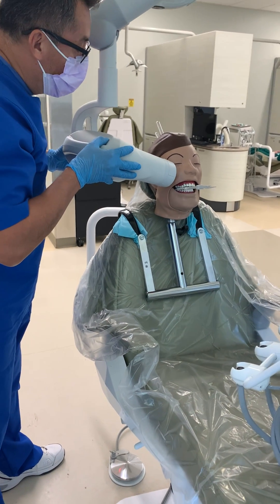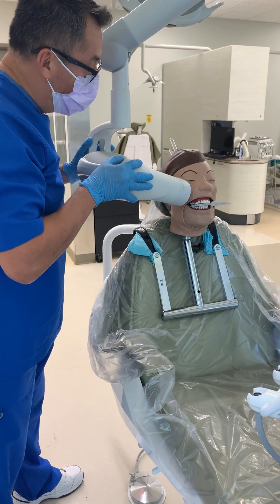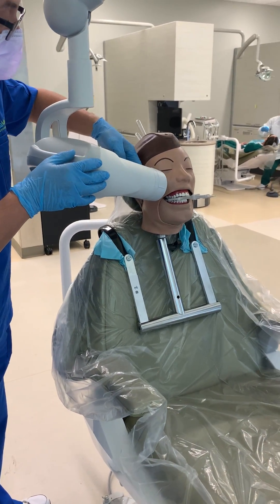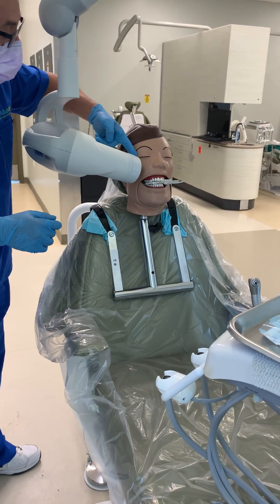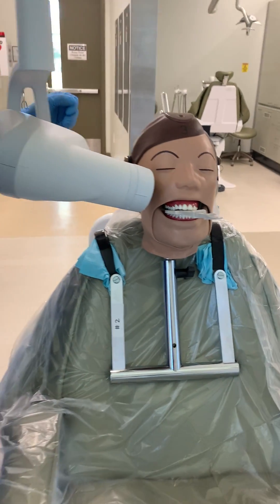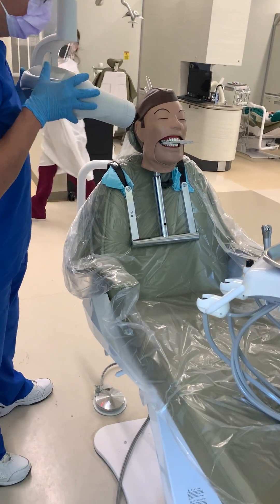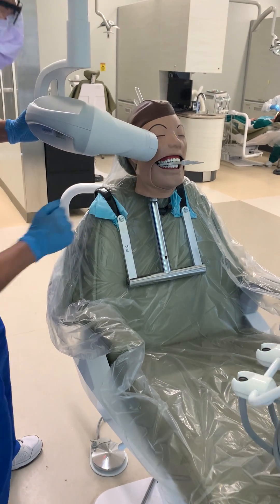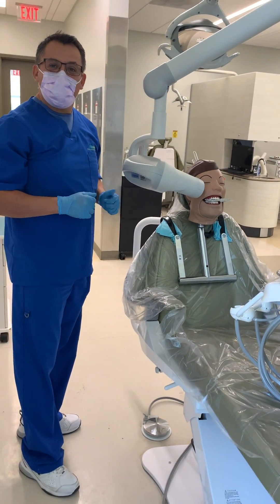Now you want to get closer to the patient. Always support the machine, and with your body, you can just push the machine a little bit, ensuring that you don't hit the patient. What I recommend to my students is to leave a space of about a finger's width — if you're able to put your finger there, you're close enough. Check the alignment here, check the alignment there, and then just go ahead and take the exposure.